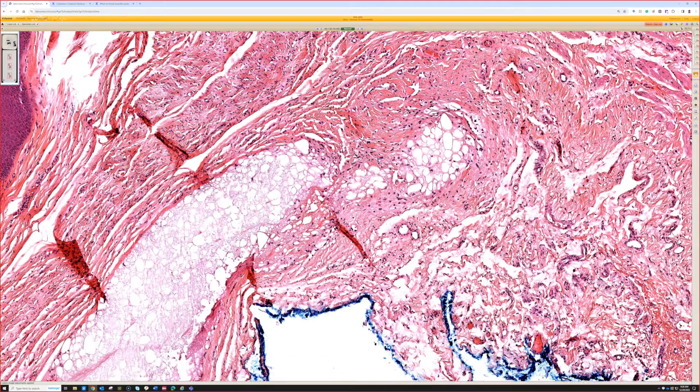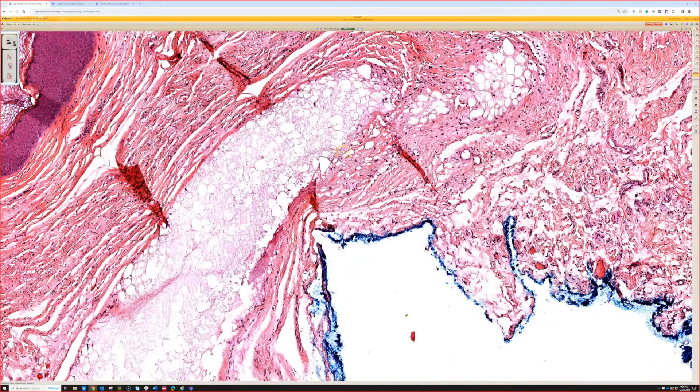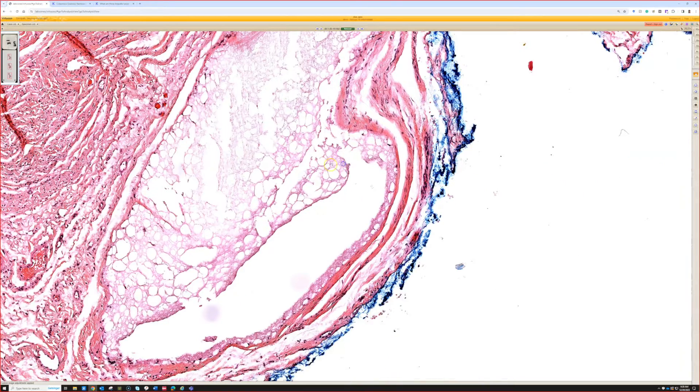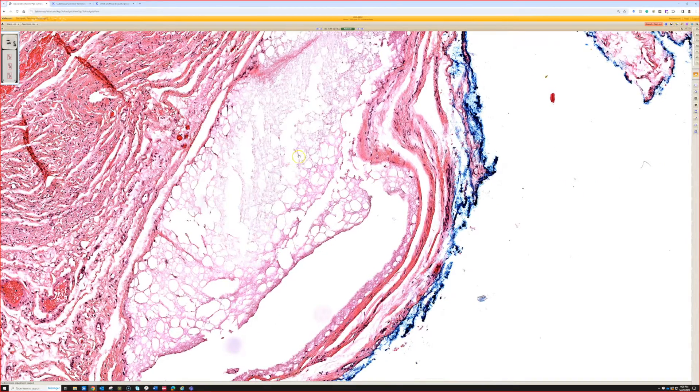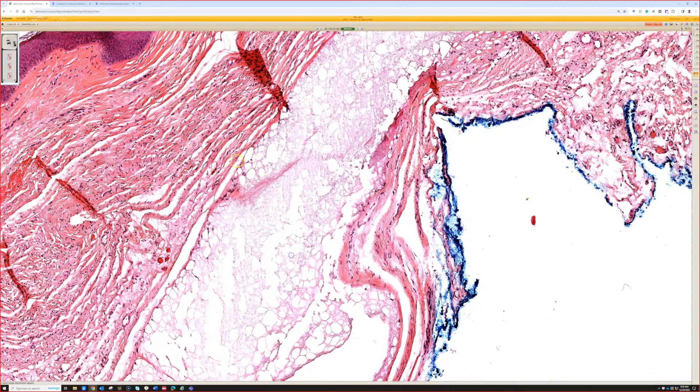And occasionally you can see histiocytes and even giant cell reaction around this, which is kind of interesting that it's a steroid that's supposed to inhibit inflammatory response, but it still doesn't seem to deter always the histiocytes and giant cells.